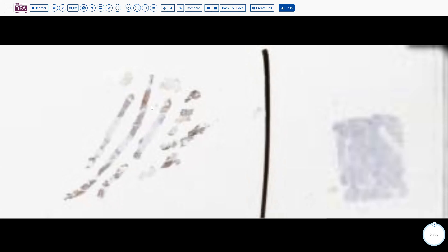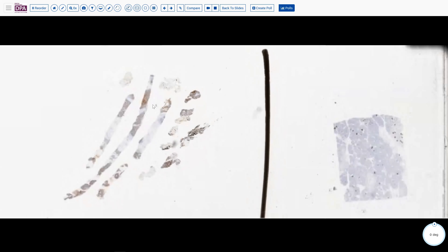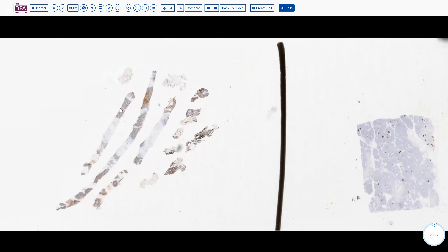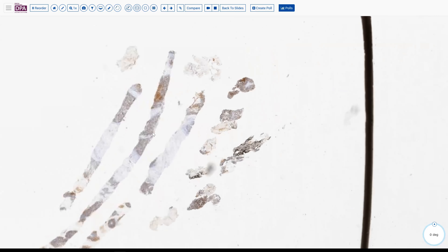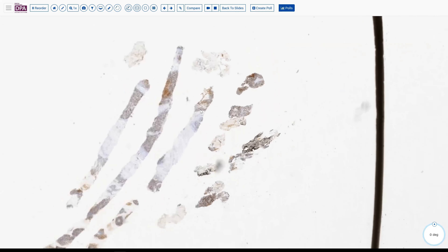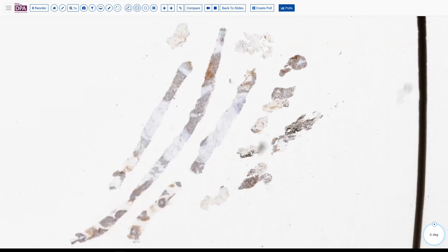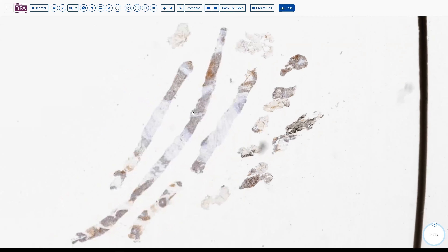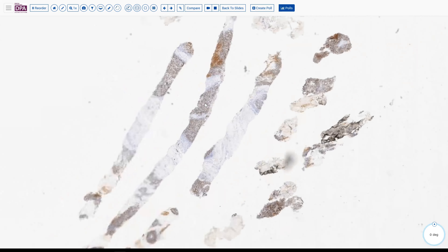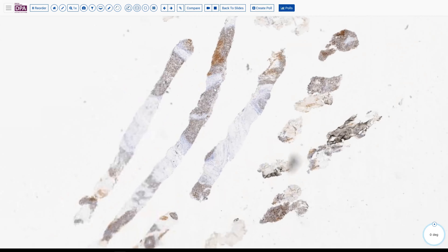Here you see the synaptophysin — with a neuroendocrine control — nicely positive in our islands of tumor cells. You can see the pale brown staining here. I won't go to higher magnification; it's pretty evident.